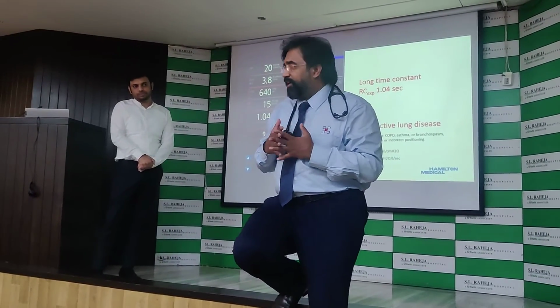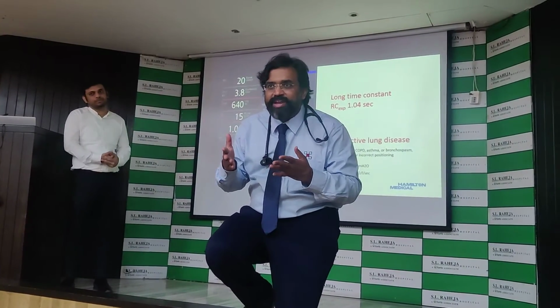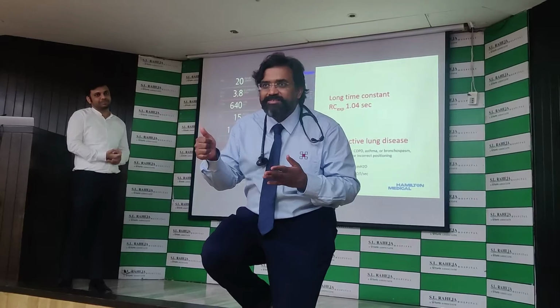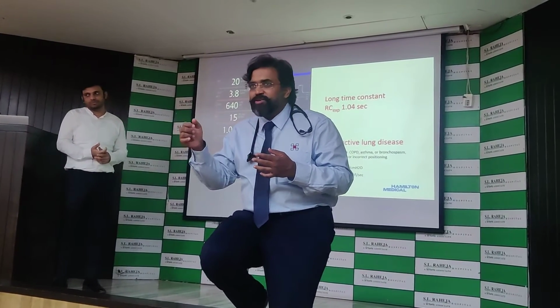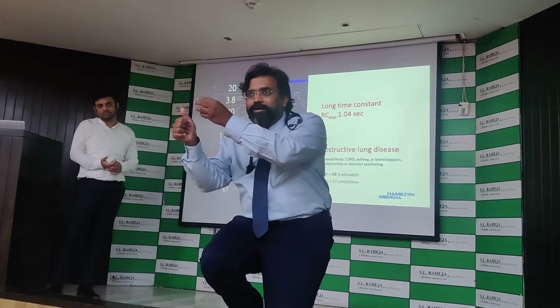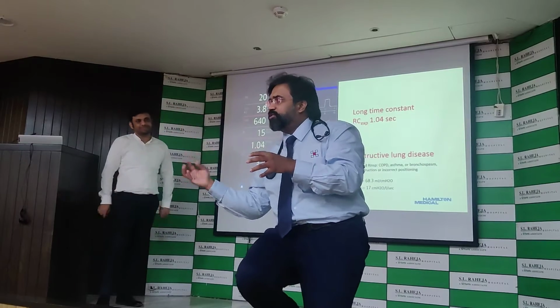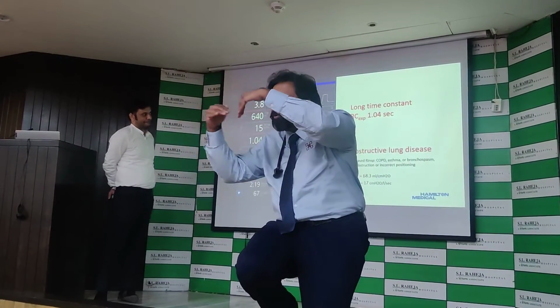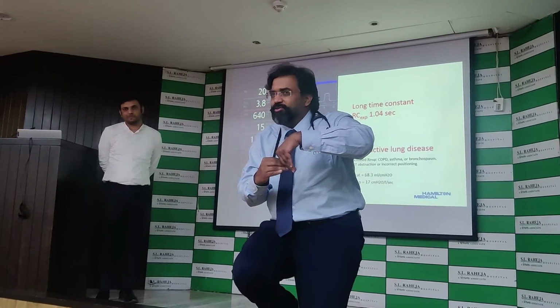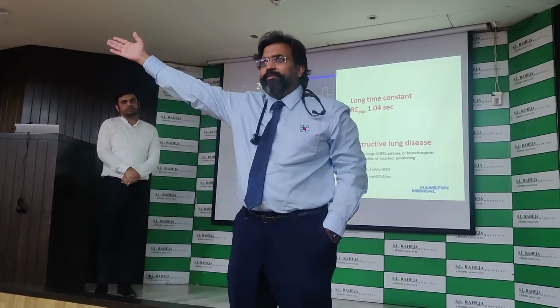Now you must also understand, when I talk to you about plateau pressure, what the time constant means. Why is it 2 seconds? Why do you have to hold for 2 seconds? Because if you hold for 2 seconds, at least some lung will approximate. The rest all have different time constants, each one different. So in 2 seconds at least some will approximate. The highest limit of time constant is 0.2, no?